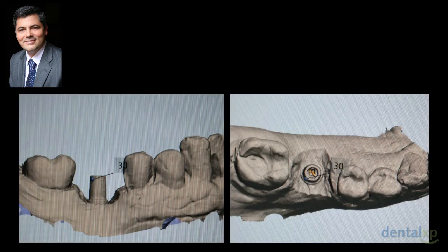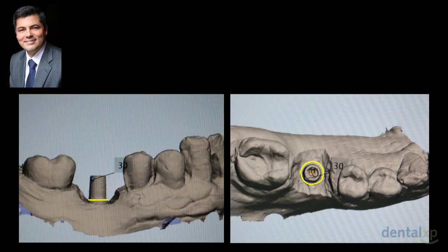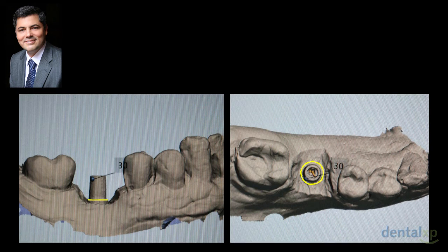And this is what's going to happen next. Once the scan is done, what you're going to notice is that you have the most perfect finish line that you can imagine. Beautiful. The sweating is over. I've been utilizing this technique since 2001 when I got the ZX2 in my office, and I was going crazy with that ZX2 because the ZX2 wasn't as easy as the type of models available today. So instead of fighting with the patient, fighting with the bleeding, I had to figure out how to take everything out and work outside, calm, and sometimes tell the patient, come back tomorrow or come back in 3 hours.